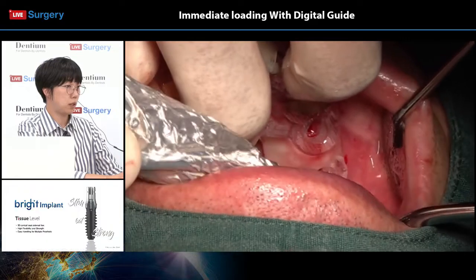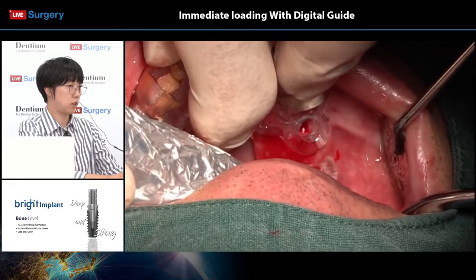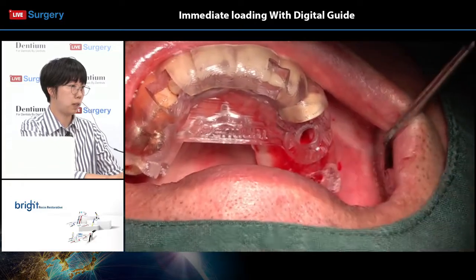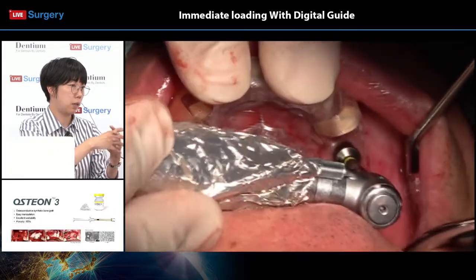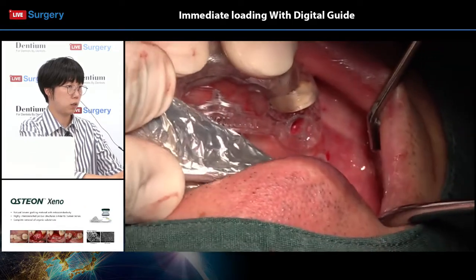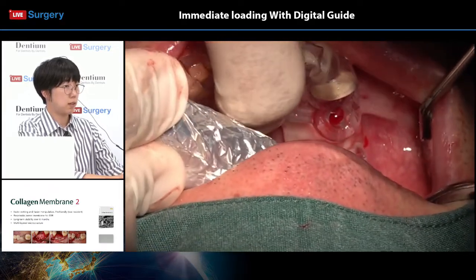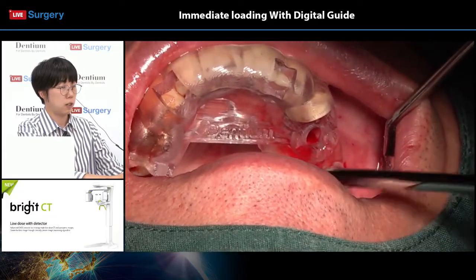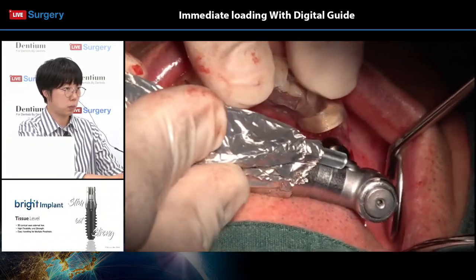As I've mentioned in the case preview, the bone density wasn't good in this area, so Dr. Lee would have to under-drill the area. That is, prep the implant size with a diameter smaller than the implant that Dr. Lee plans to place. Okay, so he's building up the diameter to 3.0. The planned diameter is 4.5 on tooth number 24 area and 5.0 on the molar areas, but we'll have to see if any adjustments would be made.